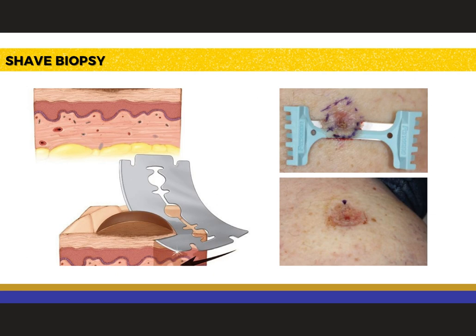Now for shave biopsy. So shave biopsy, gumagamit tayo dito ng blade as you can see here in the photos presented to you. So ang nangyayari dito, small fragments of tissue are being shaved, no, from the surface of the skin. So ginagamit natin ito most especially sa mga dermatology.